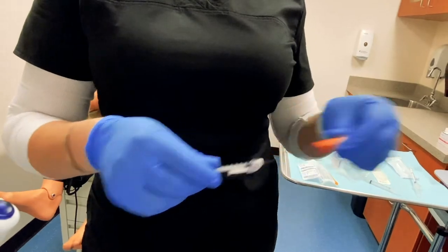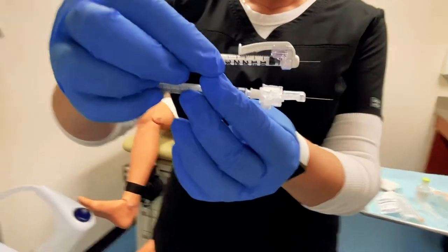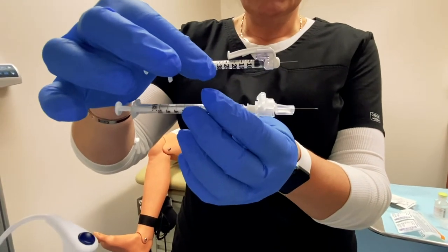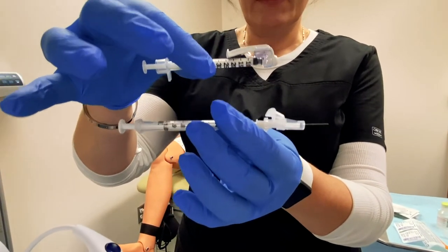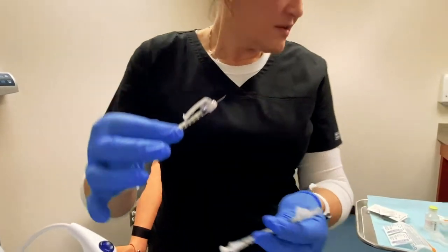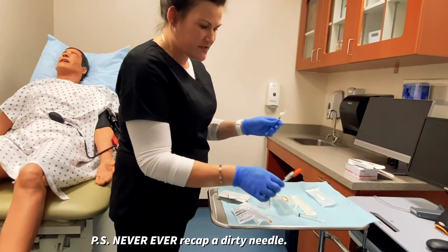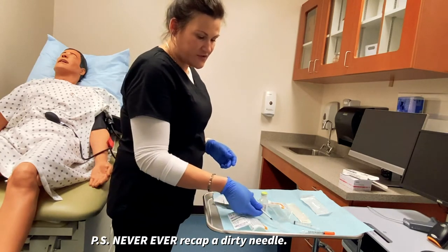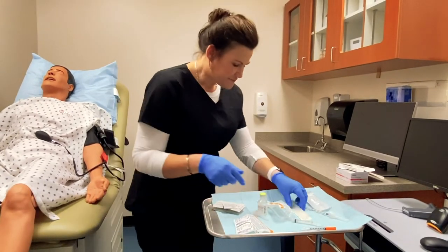You can see that the insulin needle is actually thinner than the tuberculin needle — that is because this is a 29 gauge needle and this is a 27 gauge needle. So the lower the number, the bigger the needle. When you are recapping needles, you don't ever want to put them on with your fingers. You want to lay the cap down and then scoop it up and press it down.